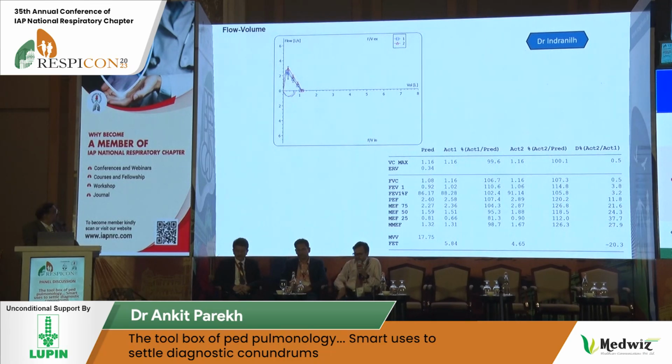The spirometry is normal. You have normal pre and post bronchodilator graphs. The lung function is also normal. So what Gautam was telling is very important. Here we require the volume time curve. Yeah, absolutely. Because it looks like a very small restrictive. If the volume time curve was there, or at least the exhalation time was given here, we could have found whether the exhalation time was more than 3 seconds or not.